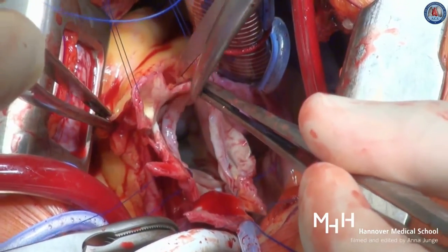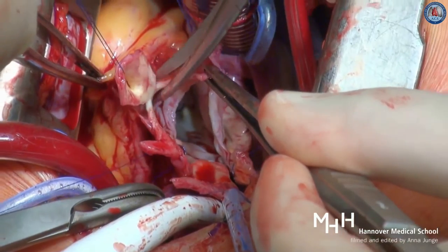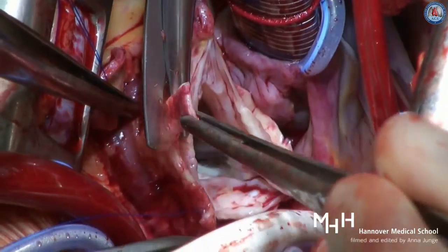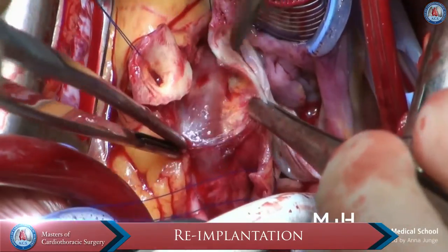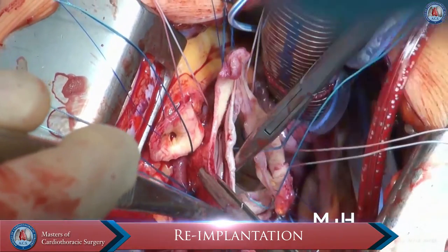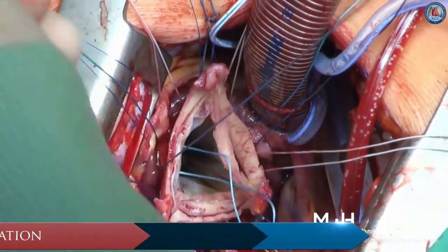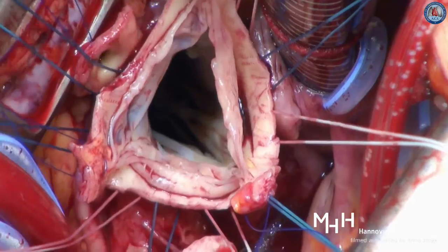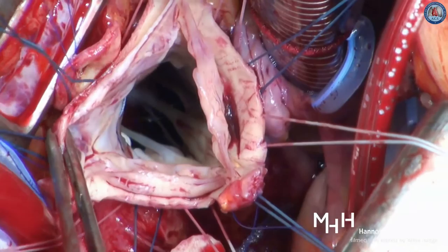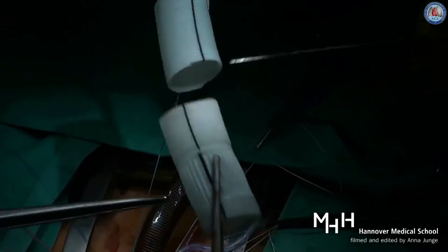In most patients, the diameter of the Dacron prosthesis is either 28 mm or 30 mm. Thereafter, 9 to 12 unpledgeted sutures of 2-0 coated polyester fiber are placed inside-out horizontally below the valve in a circumferential fashion. The Dacron graft is anchored with these sutures with the aortic root inside the graft. The graft is fixed by tying these threads loosely to avoid the creation of a subvalvular stenosis.